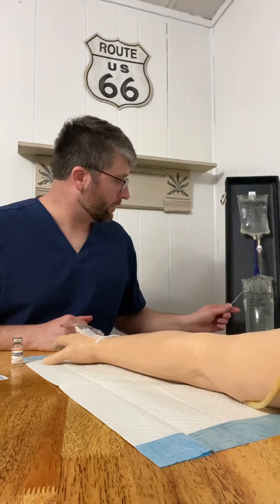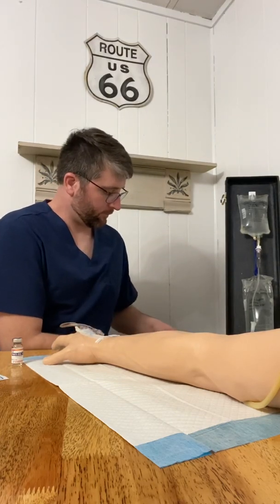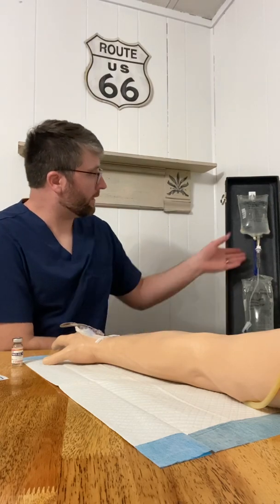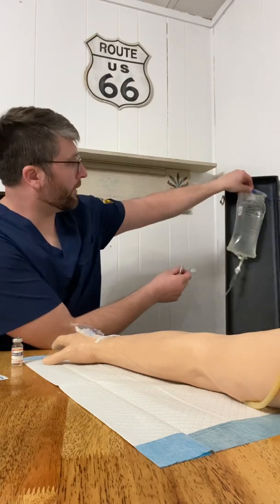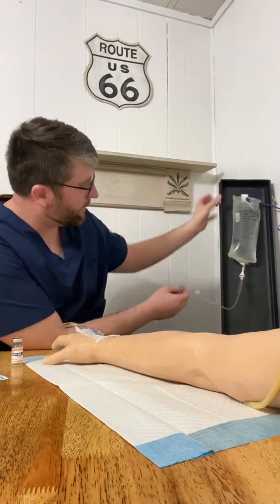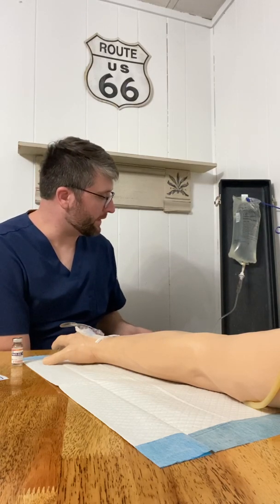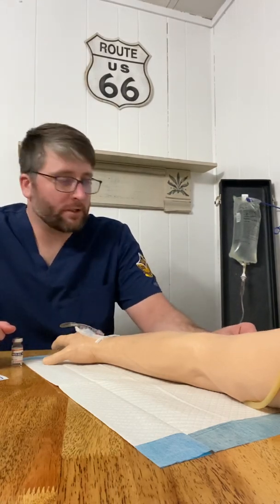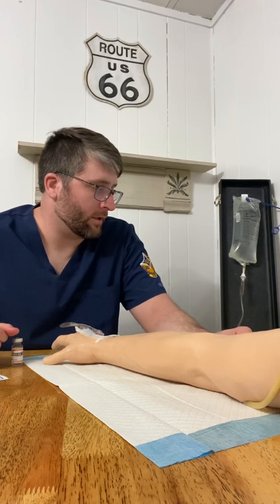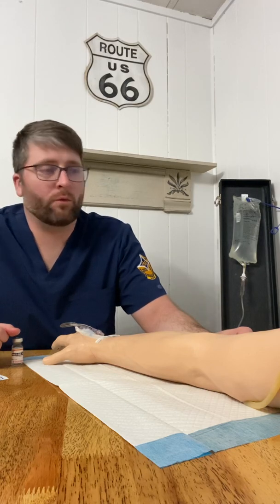We're going to close that off and take that off, take that down, and we're going to move our main line back up, and then we are going to reset our IV flow rate and document all pertinent data, check back at the patient, make sure that they're tolerating the medication well and correctly.